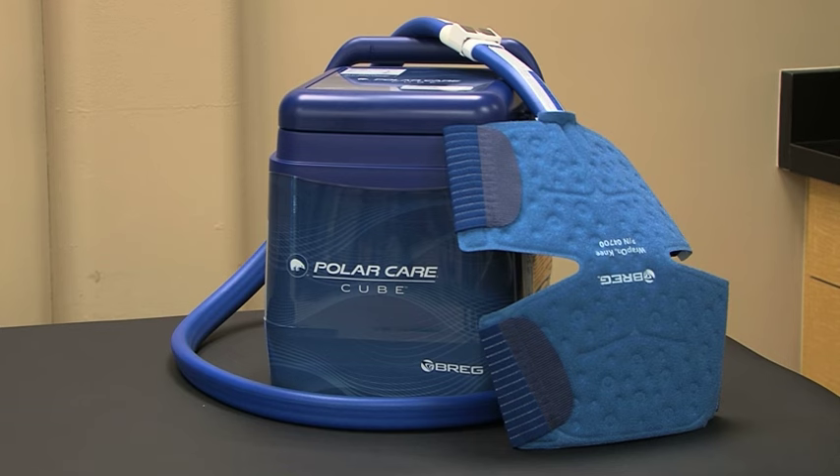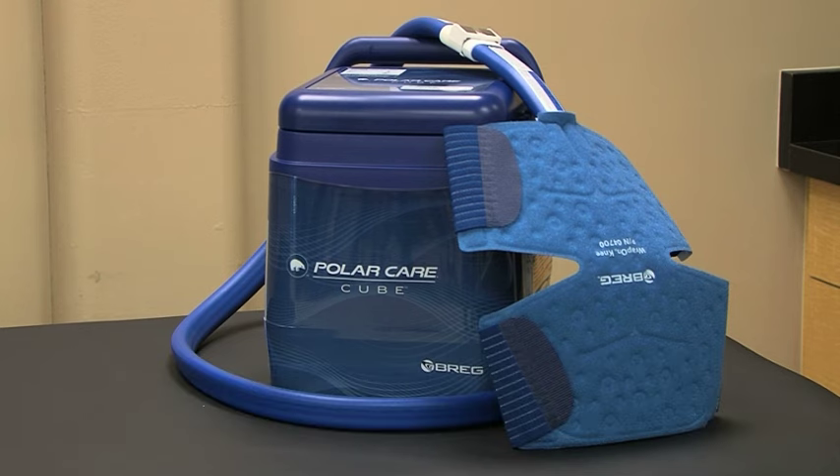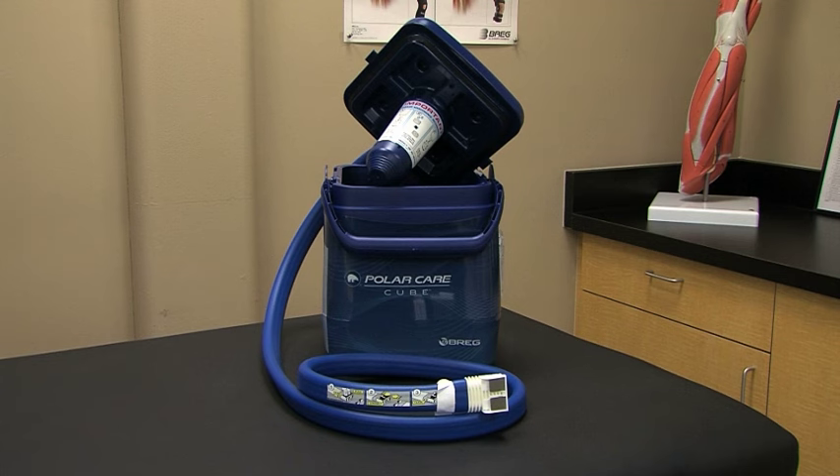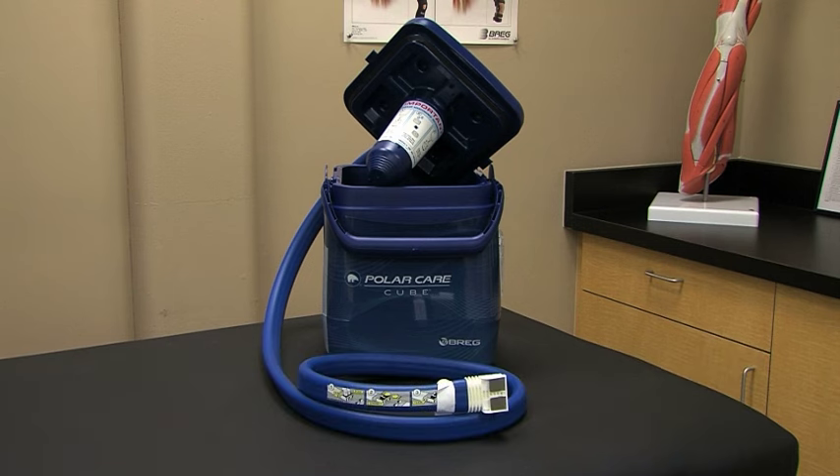Be sure to use the PolarCare Cube as prescribed by a licensed healthcare professional, including how often and long to apply and when to take breaks from cold therapy. While there are many benefits to the use of cold therapy, a word of caution: cold therapy systems can be cold enough to seriously injure the skin, so be sure to follow these instructions carefully.